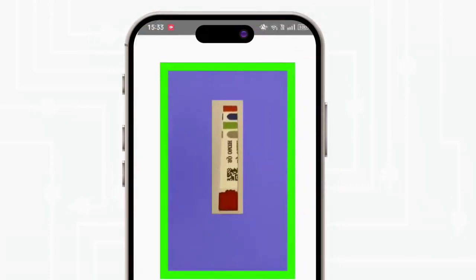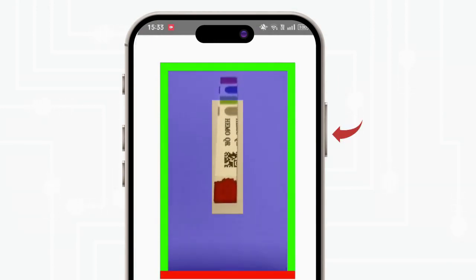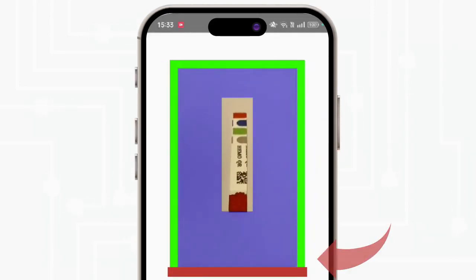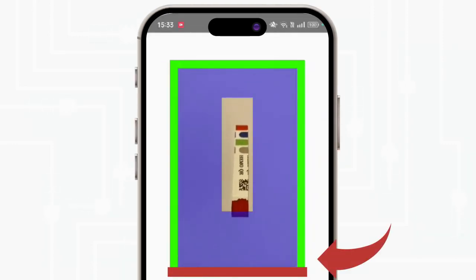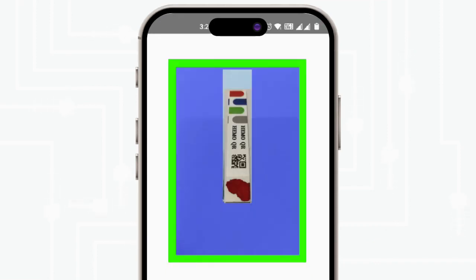The camera will open. Make sure the strip is kept on a white background and you hold the camera properly. All the sides should be green in color. If any side shows red color, move the camera accordingly. Once all sides are green, click the image of the strip.